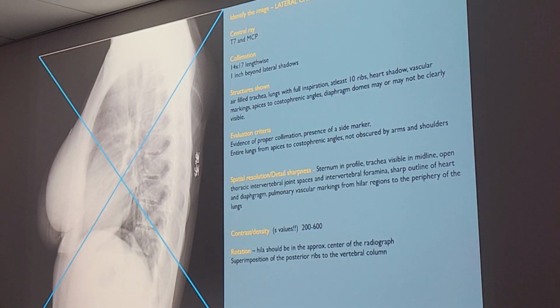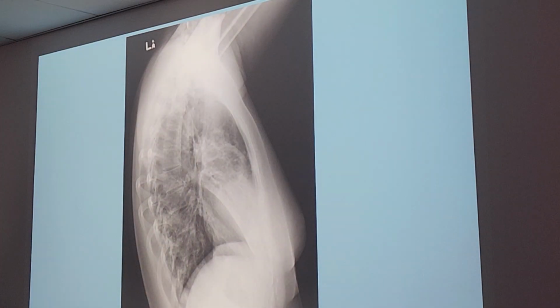Scoliosis. Yes, scoliosis. So when their spine is curved, most likely you will not be able to get a perfect lateral. I got a good one. You wanna see it? I'll show you. Scoliosis? Yeah, and I had a good lateral. They have a very bad scoliosis. They were trying to fix it, so he had to raise it up.